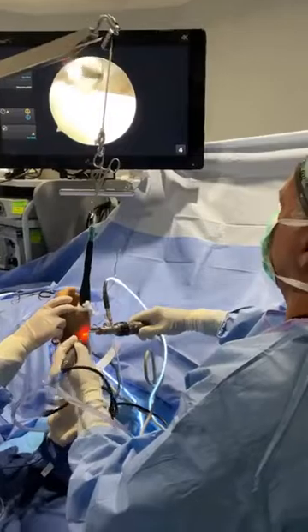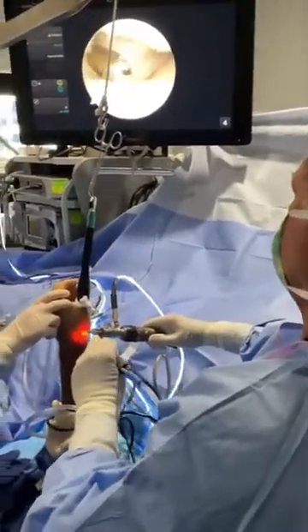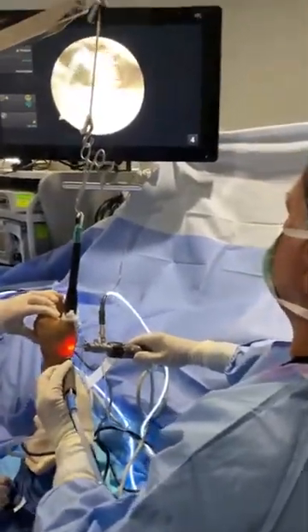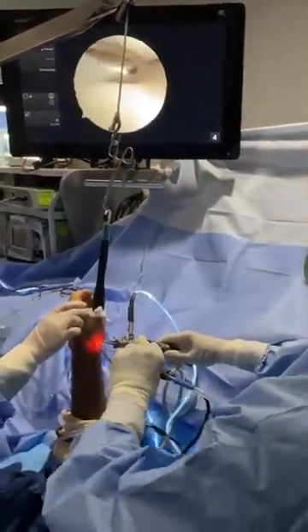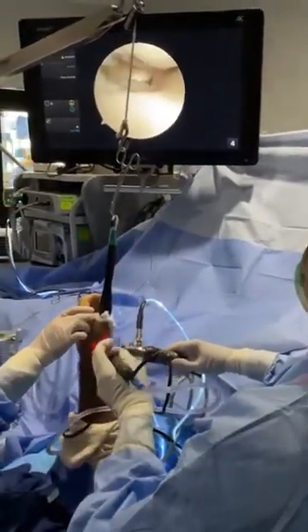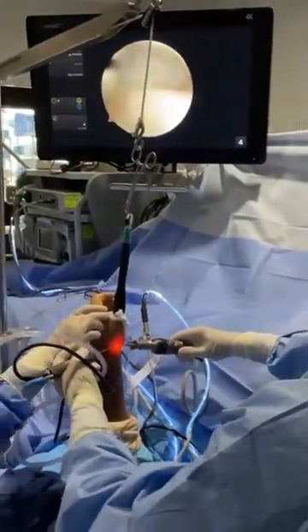Sometimes we can do injections of a biologic — growth factors. PRP, platelet-rich plasma, is not ideal here because it's too small a joint. So I use an off-the-shelf product — there are a few on the market, I use one called CTM — and we put it in with a little anesthetic under fluoroscopy to make sure I'm perfectly in the joint.